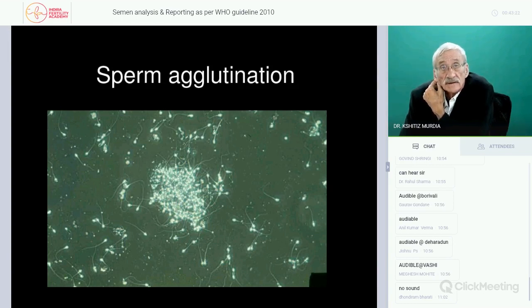And this, if you are familiar with this problem, these two sperm, for instance, are swimming in all crazy directions, but they are still alive and moving, but they are bound together by antibodies. And also this clump can move over the field because all the sperm are still alive but clumping together.